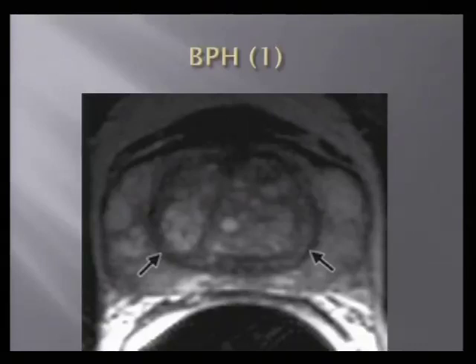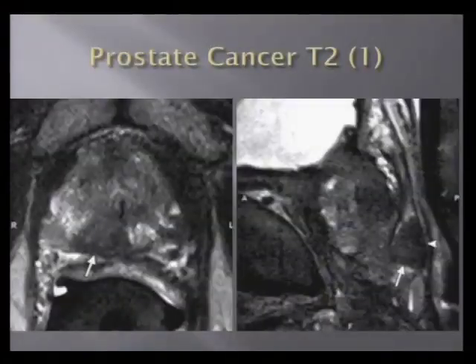And that's important because usually there's not really much of a concern about the peripheral zone because the urologists know about this. They got it in their biopsy because the rectum, which is the bottom of your screen there, is right where the needle will come in, unless you're doing a transperineal biopsy, which you'd be more likely to get more of the apex of the prostate. But the reason the central gland is somewhat important is, as I mentioned before, that might explain the negative biopsies with the persistent elevated PSA that can't be explained. And so we have to understand it when we're imaging.